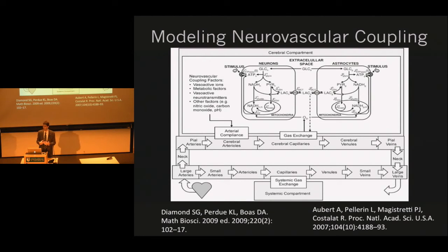So here we're doing a modeling exercise where we're taking this finer grain information about neural metabolism and connecting it with a brain circulatory model so that we can take for example, our NIRS data and better understand how a metabolic disorder or disruption of the physiology is going to look in our data. Because we don't really know what drives these signals statistically unless we dig in either with a model like this or quite directly through partnership with another lab doing invasive readings. So this modeling exercise takes us closer to interpretation of these data.